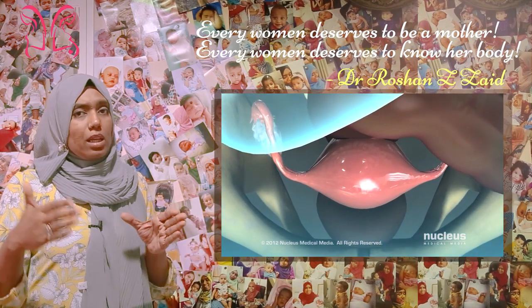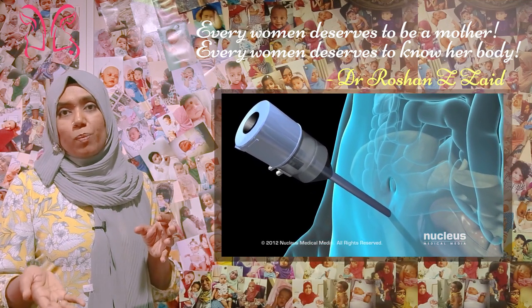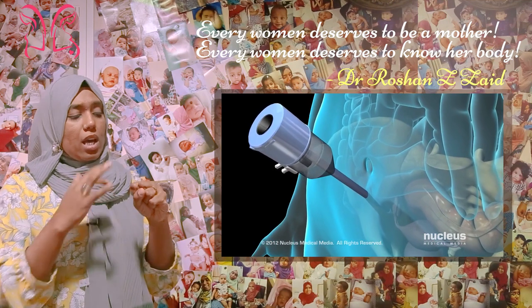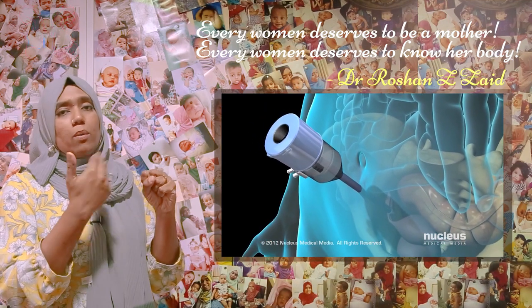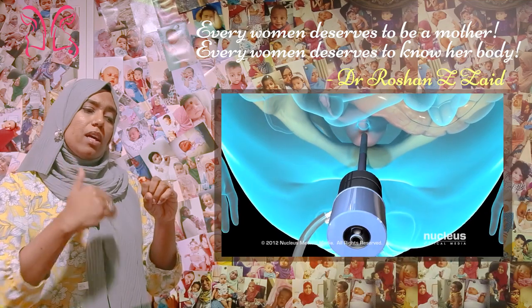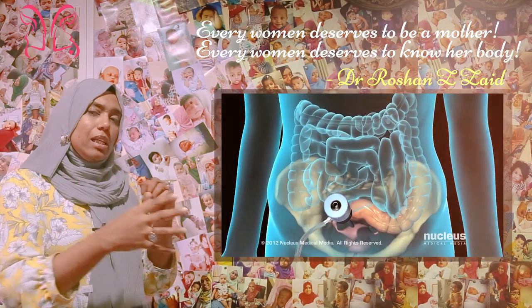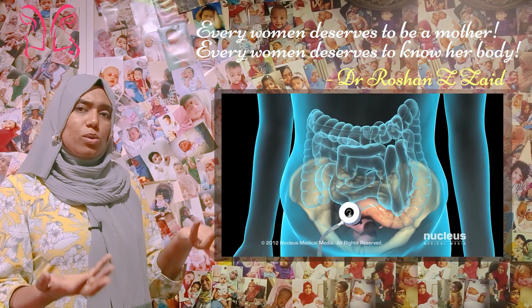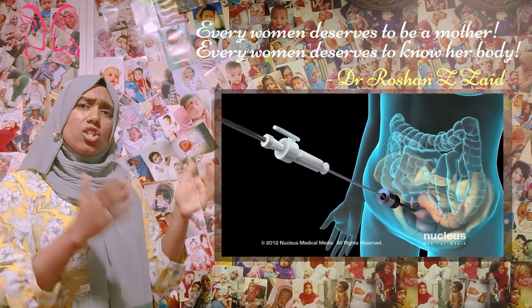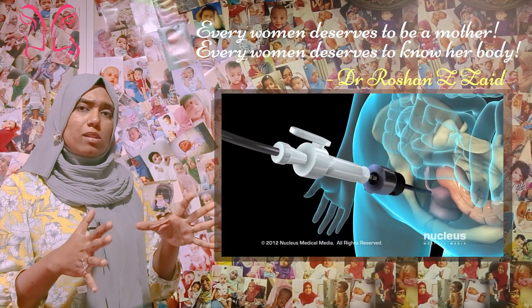By doing a laparoscopic hydrotubation you get additional information too. You get to see how the uterus looks, how the fallopian tubes are, how the ovaries are, whether there are any adhesions, and whether there are any unwanted patches or bleeding issues outside like endometriosis. All these additional valuable pieces of information are gathered when we do a laparoscopy.